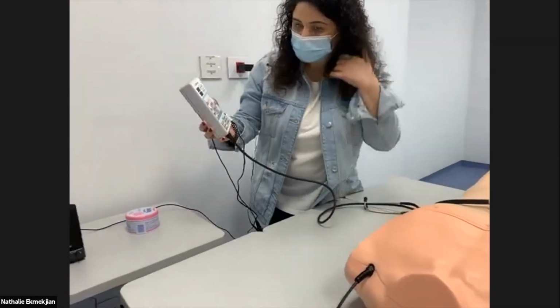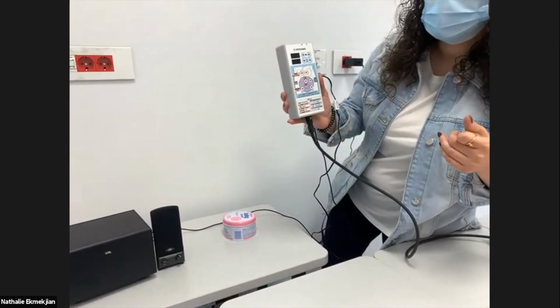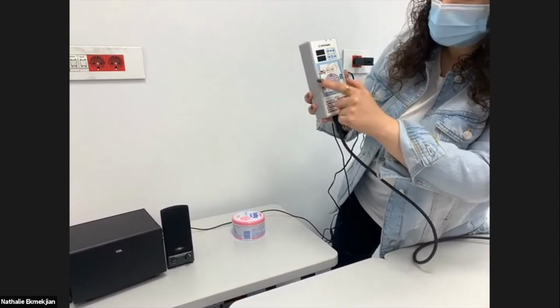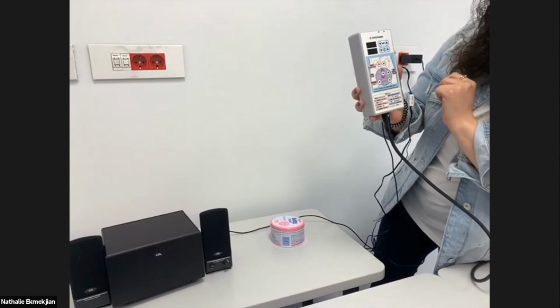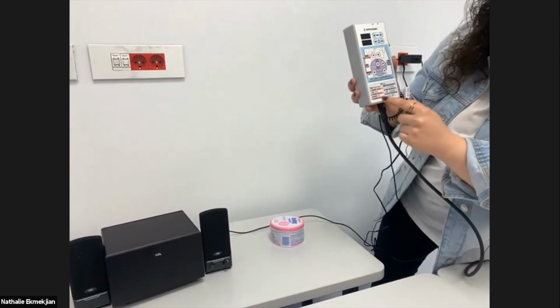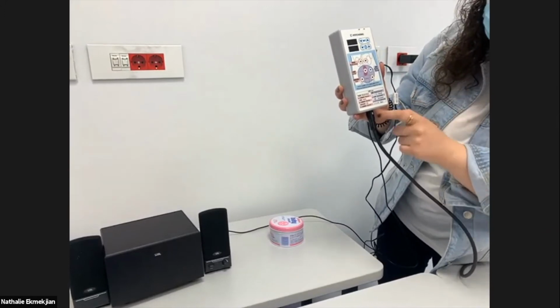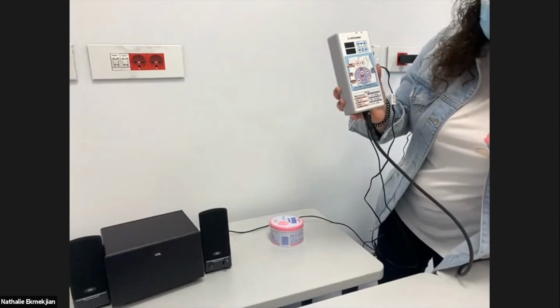Okay. As we can see here on the controller, I'm not sure if you are able to see. So we have those auscultation positions, sides. So we have the renal artery left and right. We have the aorta, renal aorta. We have the CIA, and we have the bowel sounds. And here we have the cases. For the bowel sounds, we have normal and pathological bowel sound cases. For the renal artery and aorta and CIA, we have the normal sides.